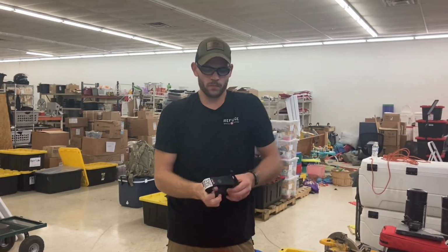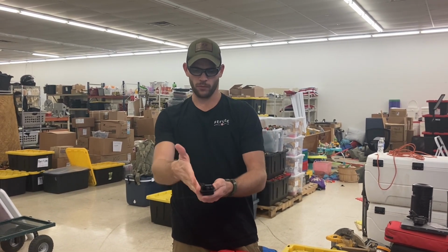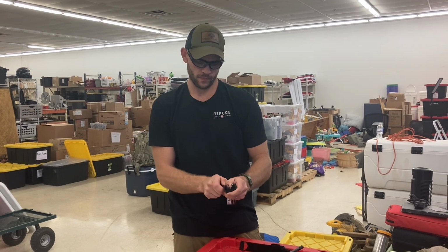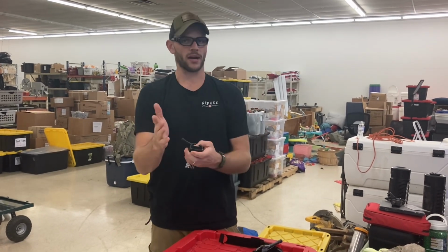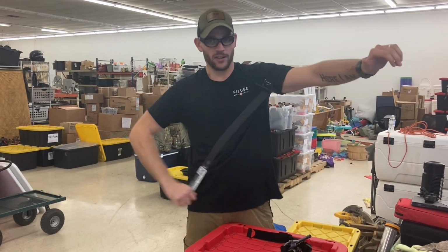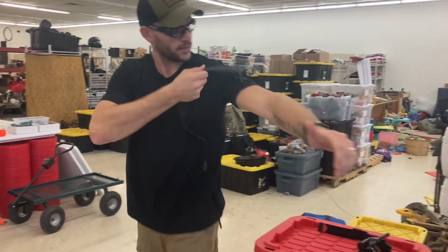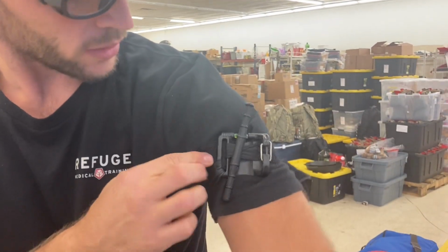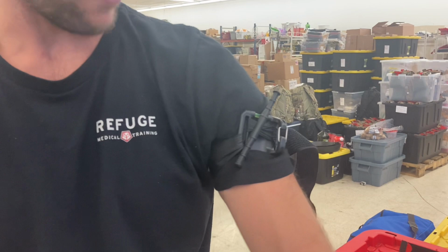Now with this one, same arm, generally a similar staging position. I can't put the windlass like this where it would fit easily in a pocket because then I can't get it out one-handed. That's not going to work. So I have to stage it more like this, possibly, and run the risk of it going in there or sideways. So it doesn't fit in the pocket as easily. Then if I throw this on my arm, again, I need to pull towards my core like this. Otherwise, if you're trying to pull out here, it doesn't work. Shift it, pull it tight. You see it happening right now. I didn't do anything unusual. I'm pulling it tight and it's already torquing to the side. Nothing unusual, and it was preset. I already folded everything back straight.